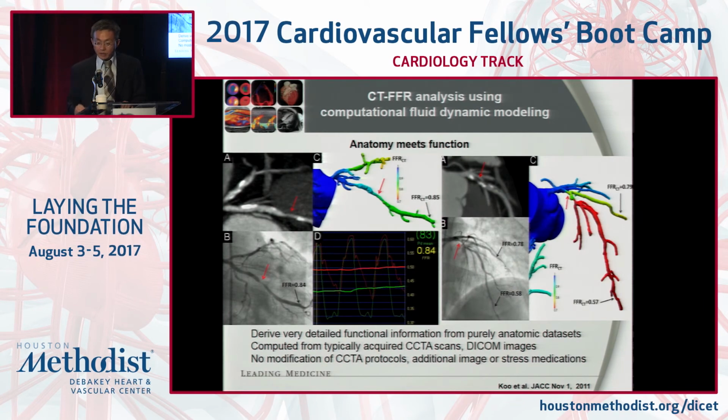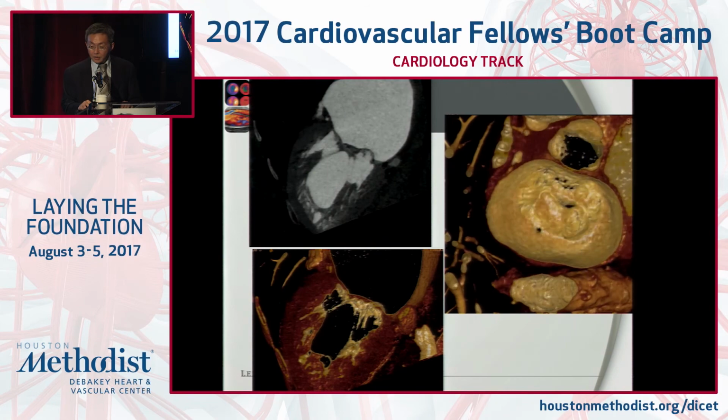The other major development is what we call CT-FFR or virtual FFR. This is a technology with a lot of research going on, and I think it's been approved by FDA. Essentially, you can get functional information from anatomical images using a very sophisticated computer algorithm. So I think it will change a lot of how we do things if the current clinical trials work out well. Okay, the last thing I want to show you is some new advances of the CT.